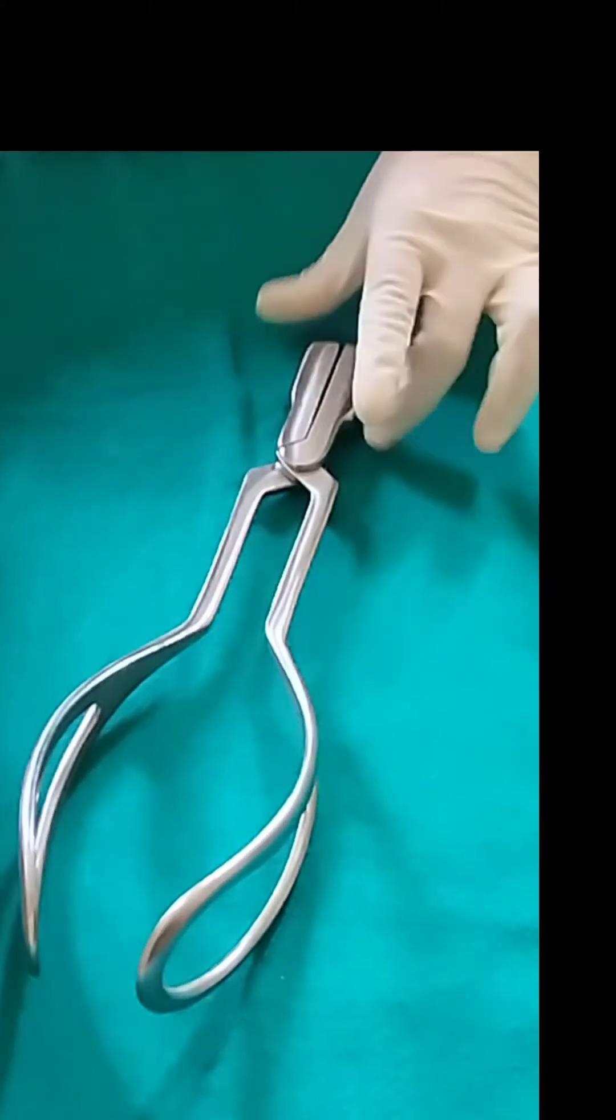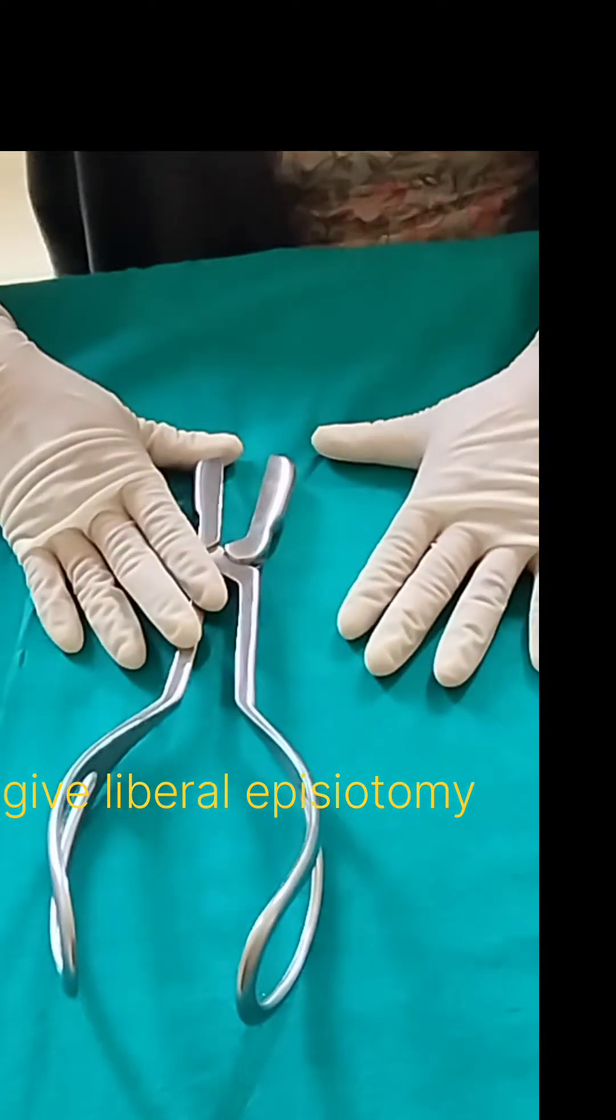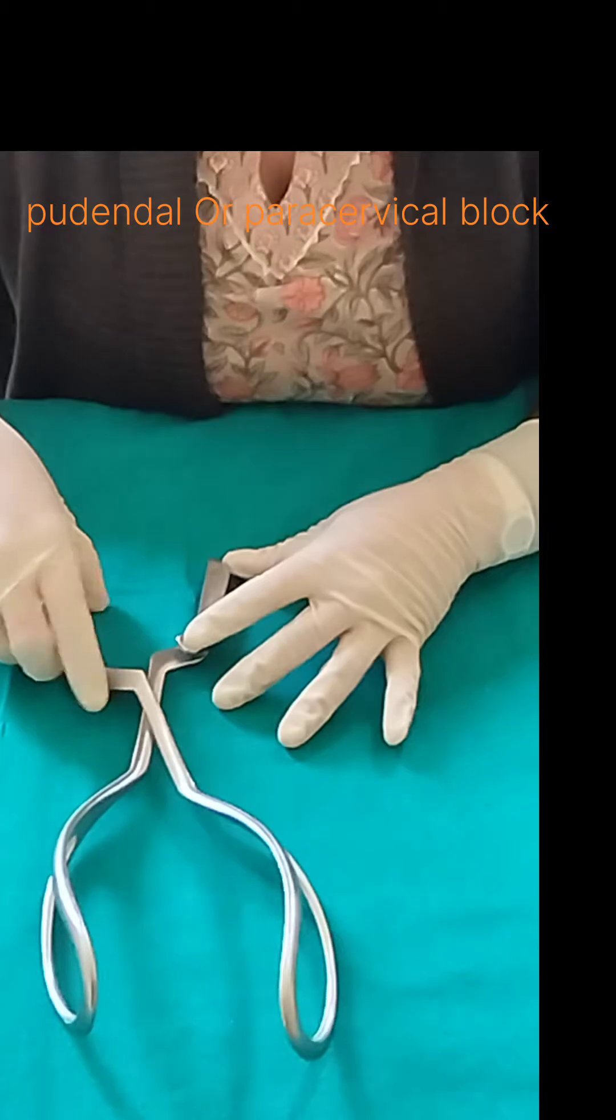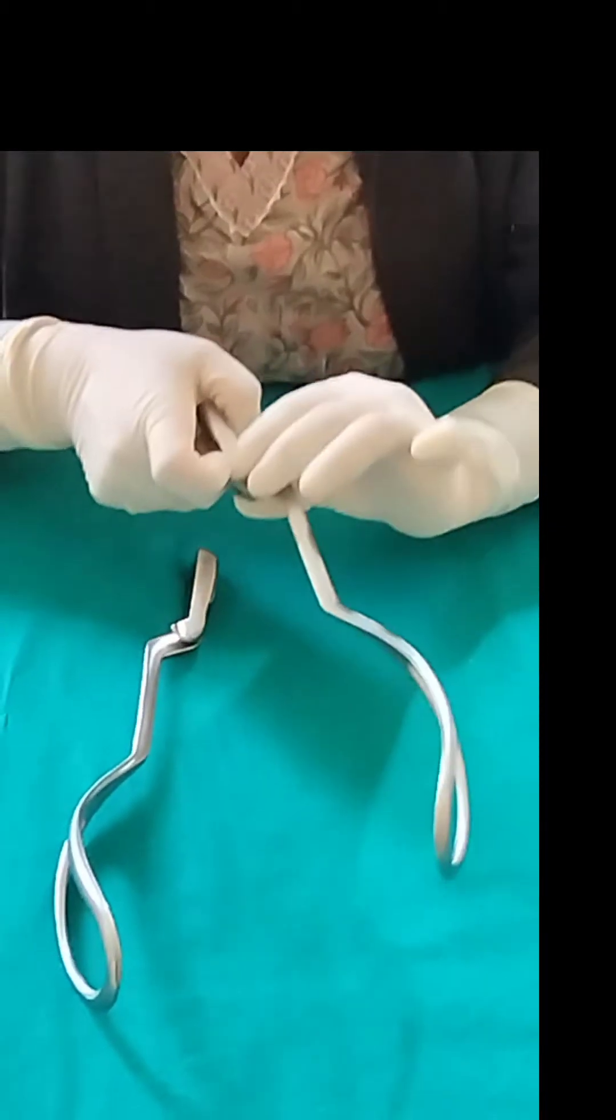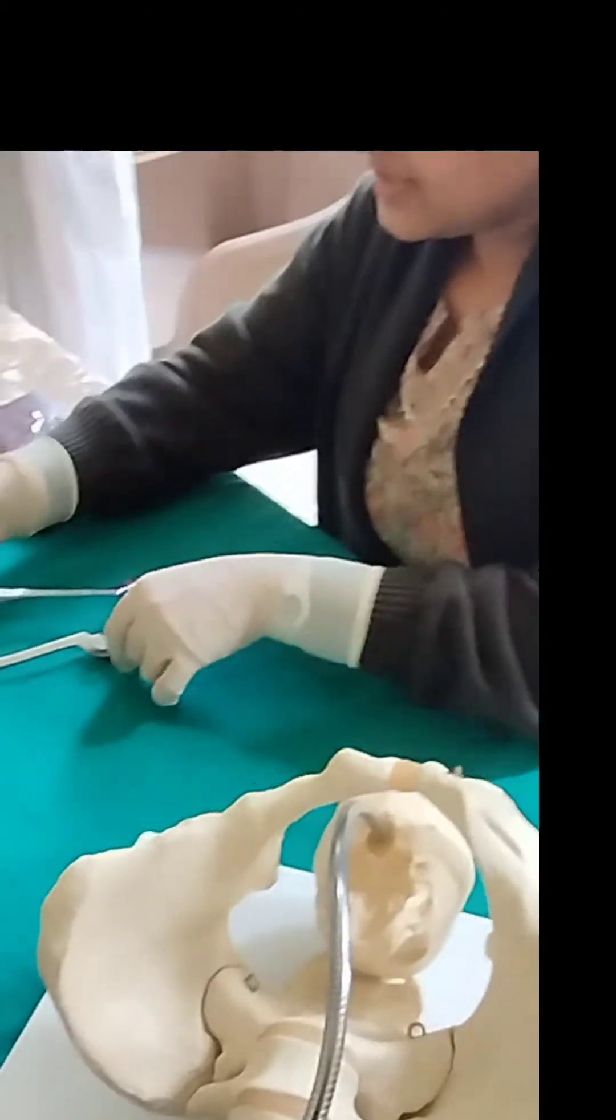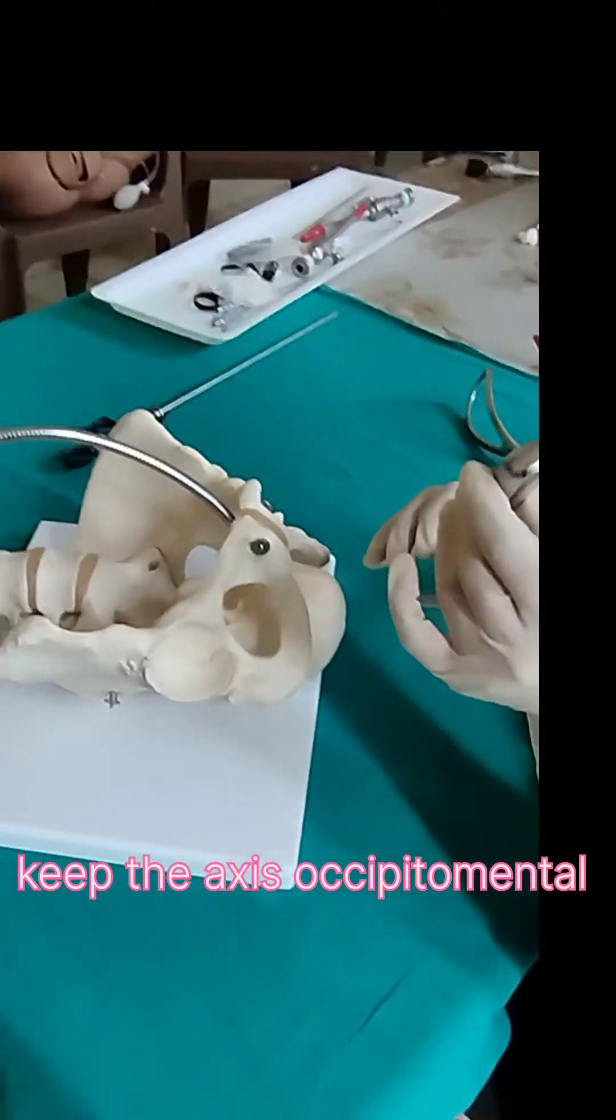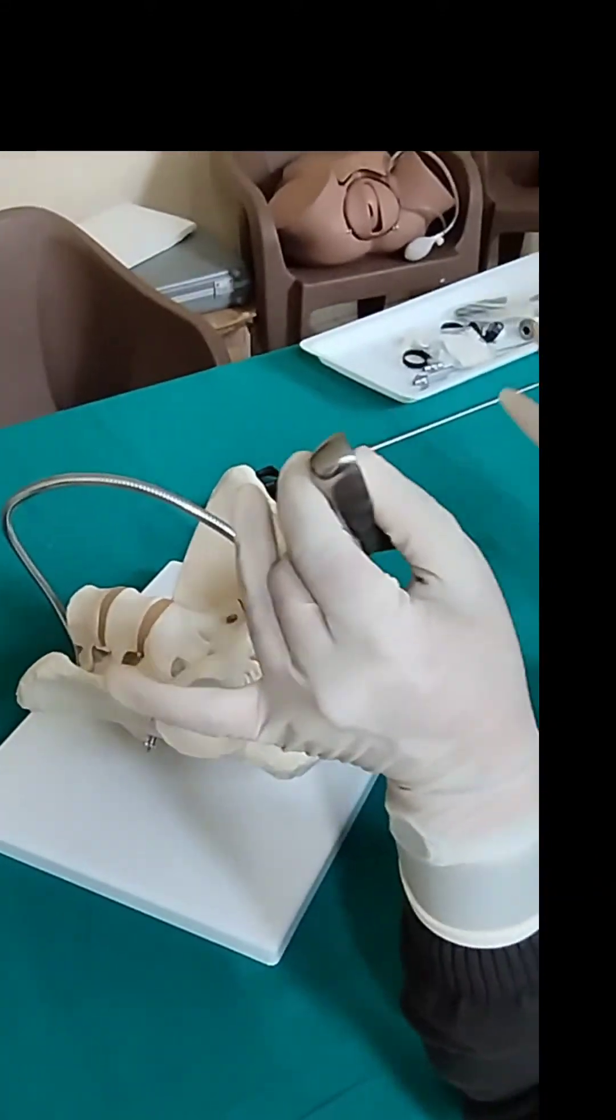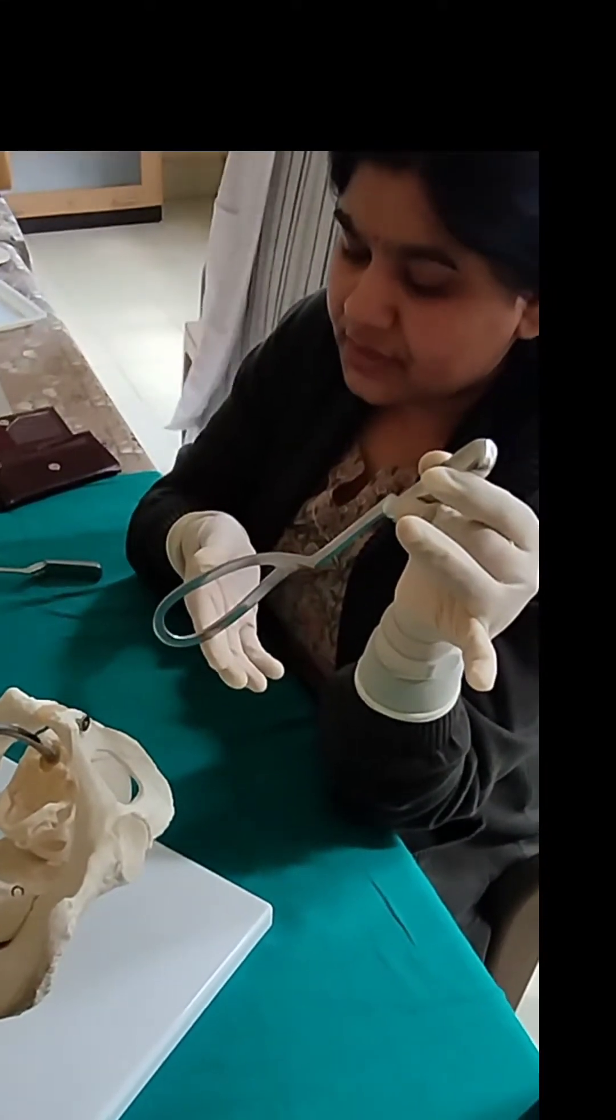Now how do we hold the forceps? Holding the forceps and application of the forceps. After prior catheterization of the patient, prior anesthesia, and after ensuring all the prerequisites, we will hold the left sided forceps in our left hand, making an angle of 45 degrees with the horizontal. This is the way we are holding. We will lubricate the tip of the forceps with some xylocaine jelly.